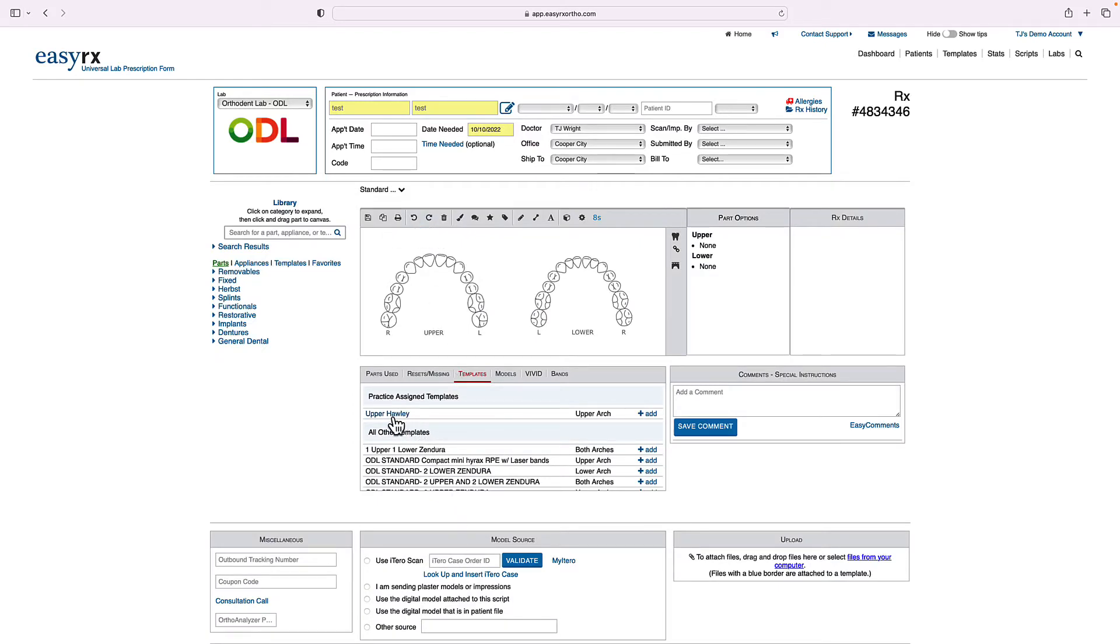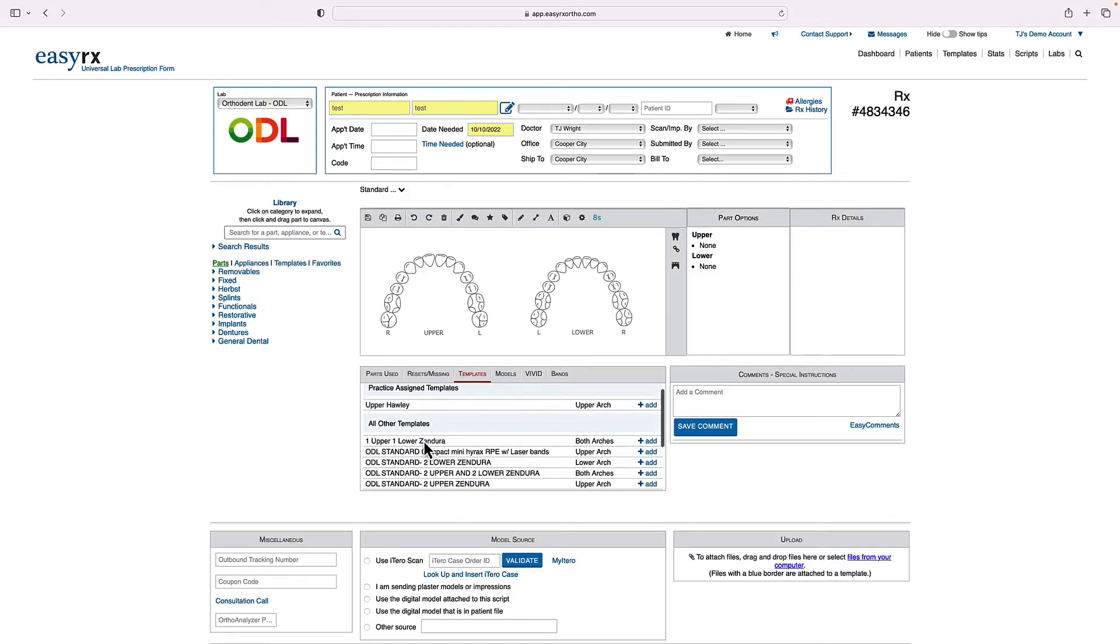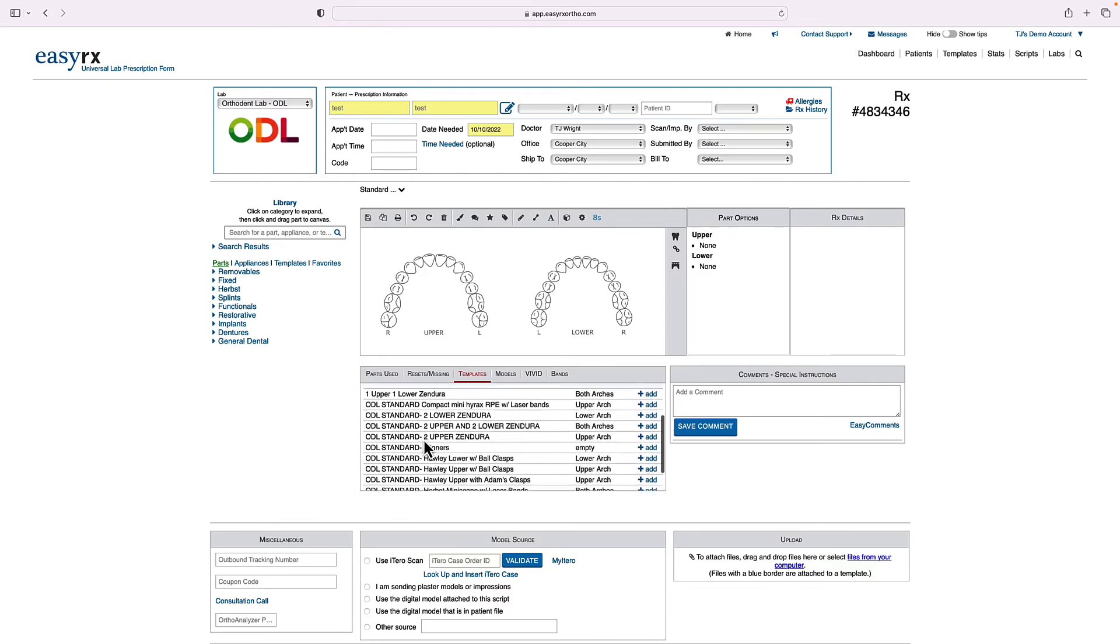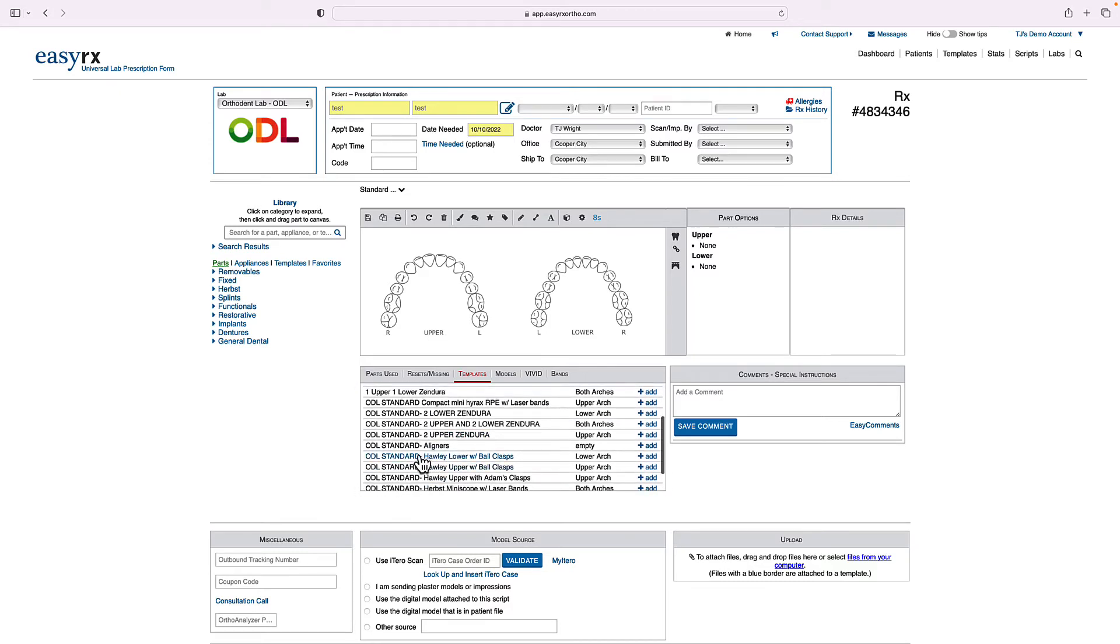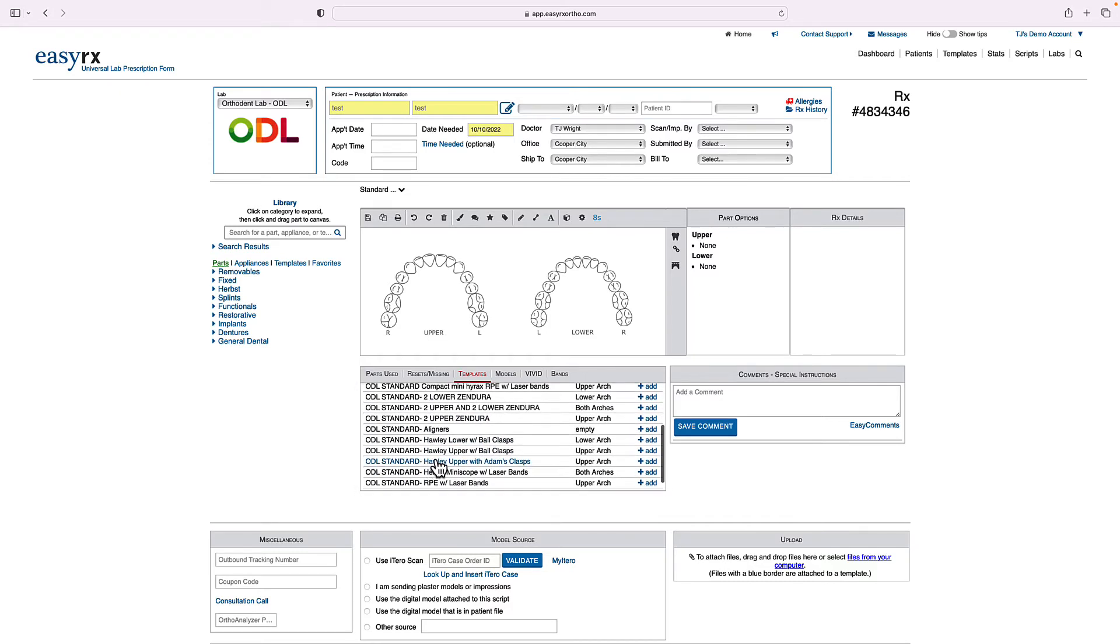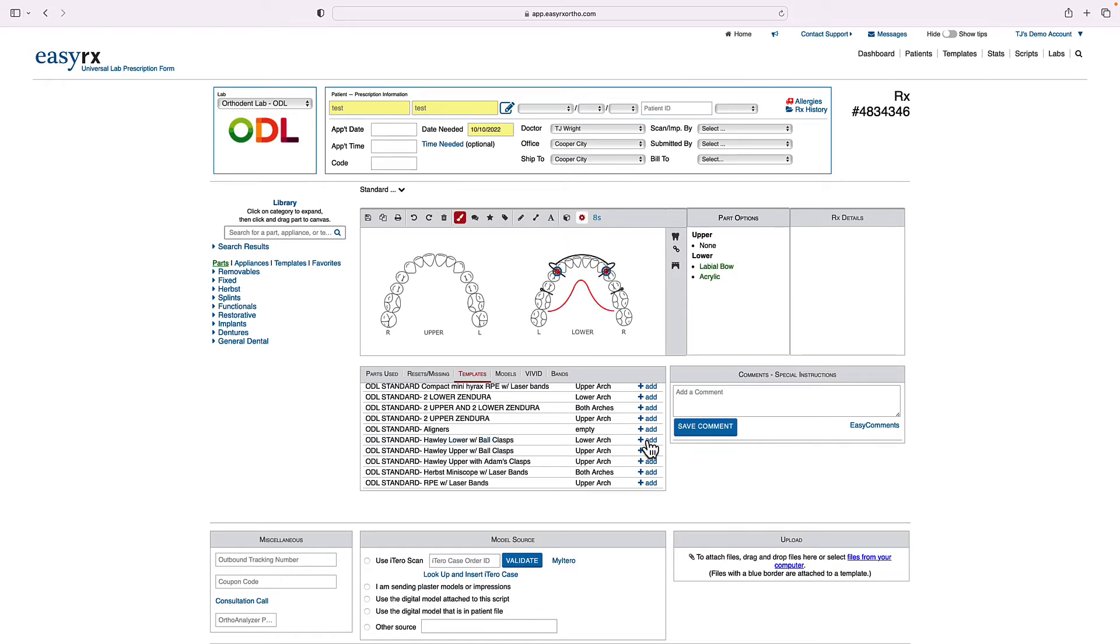And I have a template in here for an upper Holley. There are also standard templates in here with different designs. So we've got a Holley lower with ball clasps or Holley upper with Adams clasps and a couple others. So I'll choose the ODL standard Holley lower with ball clasps. Perfect.